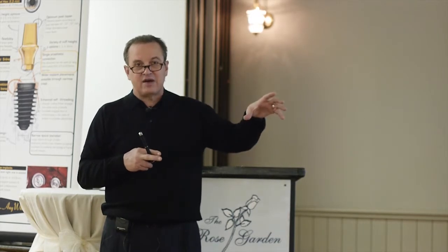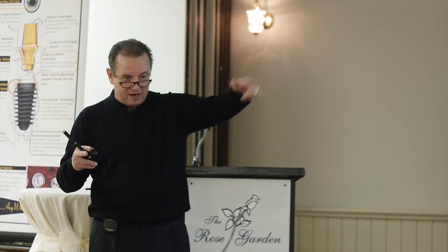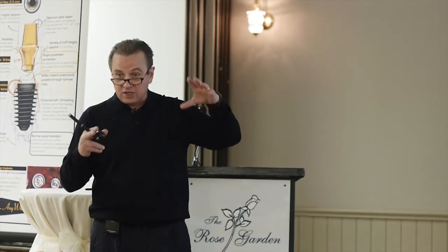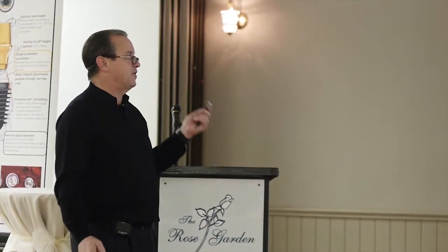And I'll tell you what happened. My partner, probably 6 months ago, had a guide made. It cost about $700. He put it in and he drilled all the holes. And when he got done, 2 of them went out of the lingual plate. You know, and I mean, he's a good clinician. I don't know what happened, but it was not a good day. Not a good day. So we look at these in all the operatories, 3D animations.